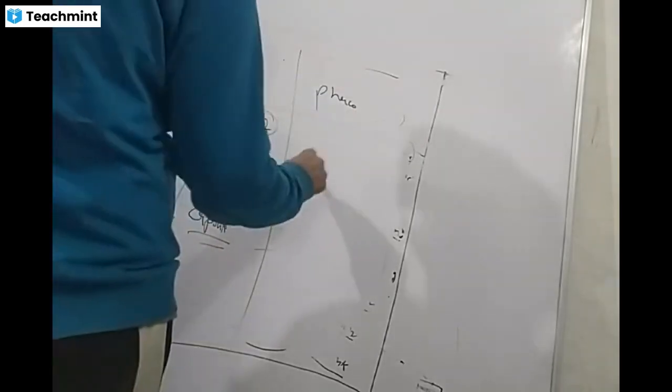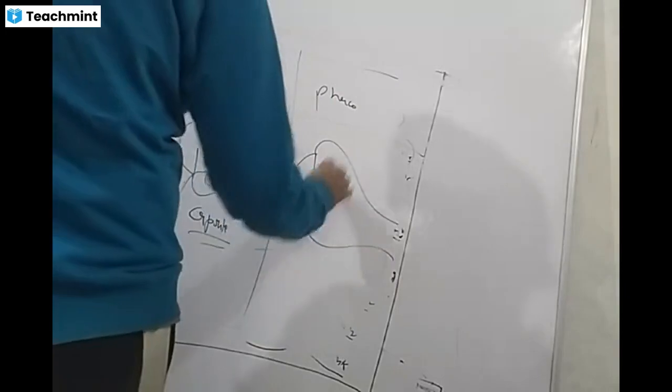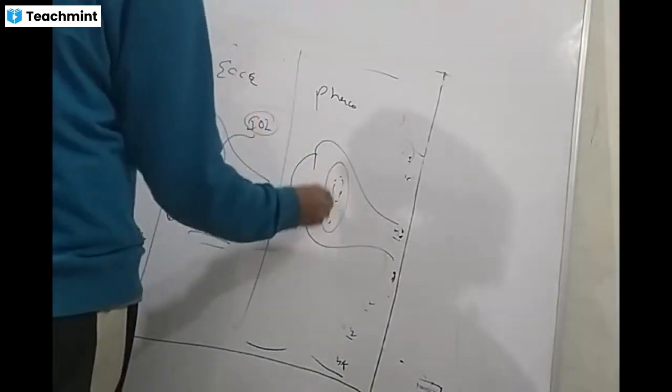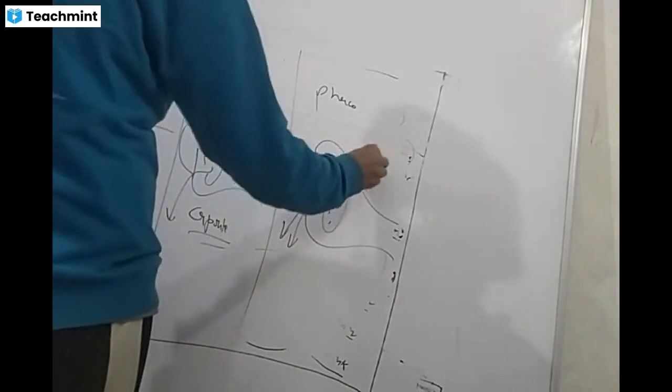In this phaco, this is the cornea, iris. Same, one nick is there. It is emulsified into powder and brought out. And now you can place the intraocular lens.